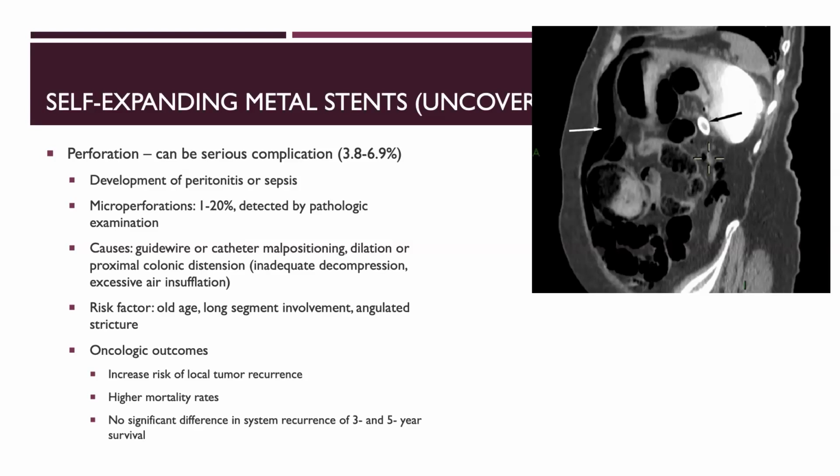So there's not enough evidence there to make it into our guidelines or to suggest that we don't do this for patients who are young. But certainly something to keep in mind that has come across in studies is that some of us may think twice when stenting young patients, especially because it may create micrometastases.